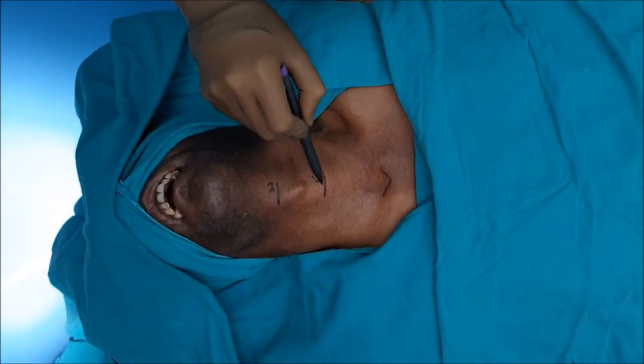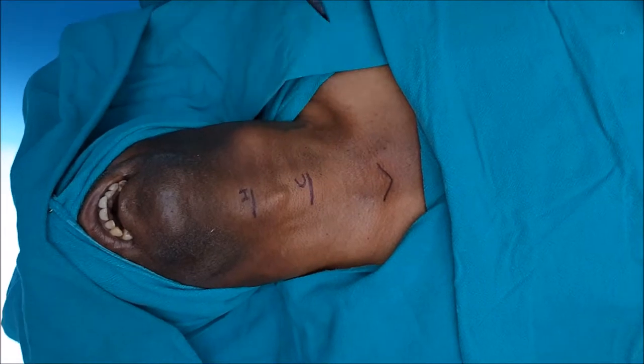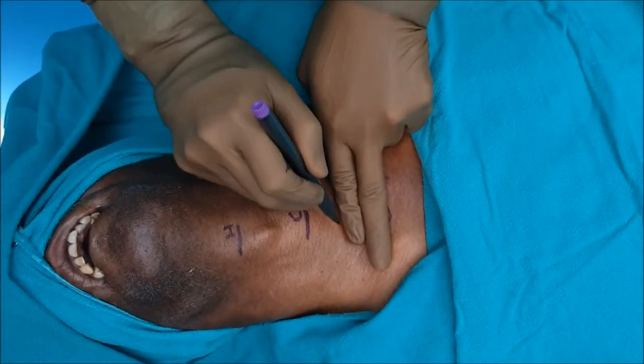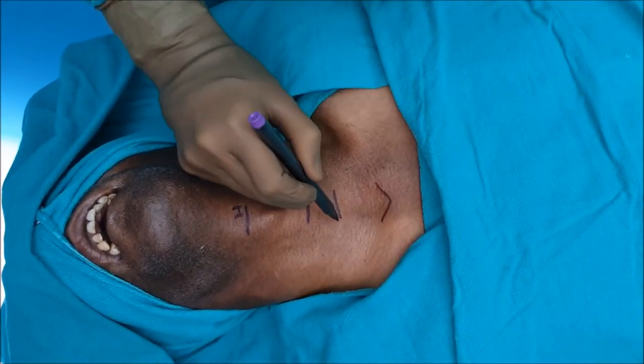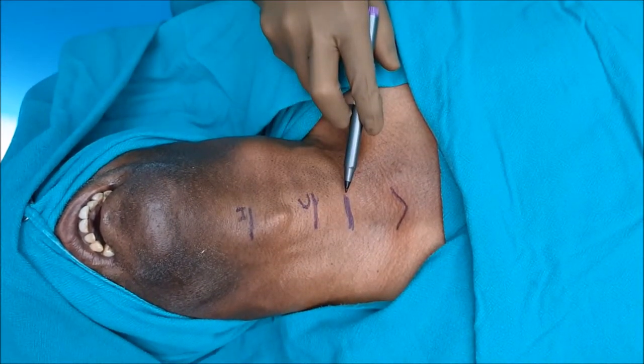Hyoid, cricoid, and suprasternal notch are marked. The incision is marked two finger breadths above the suprasternal notch. This is the site of incision.